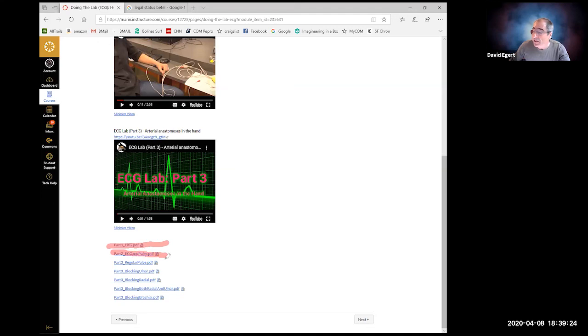The EKG and pulse one is going to show both the EKG and the pulse at the same time. And on that one, you should also annotate to show how you are detecting the timing of the pulse wave. If you don't remember, how do we know when the pulse wave begins?